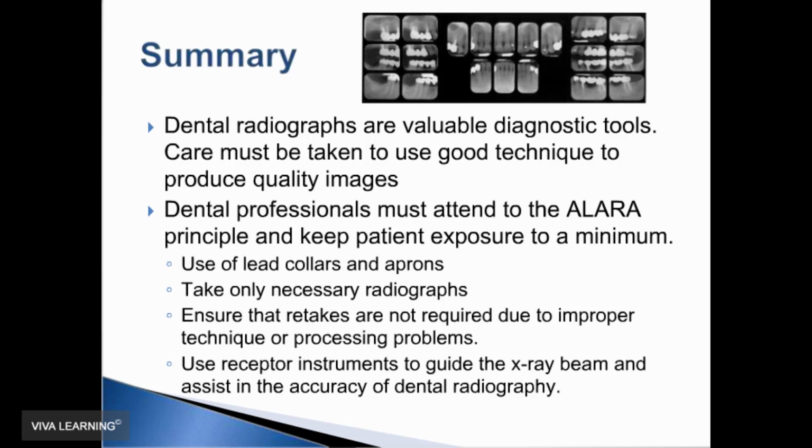The radiographs represent your clinical skills, and we often share images with other practitioners, especially those that we refer to. So the images can represent the office, and the higher quality they are, the better impression they're going to make on the patient and other professionals that view the images.